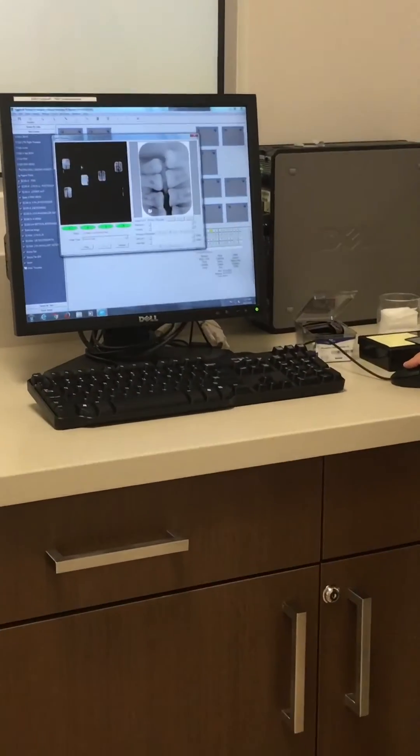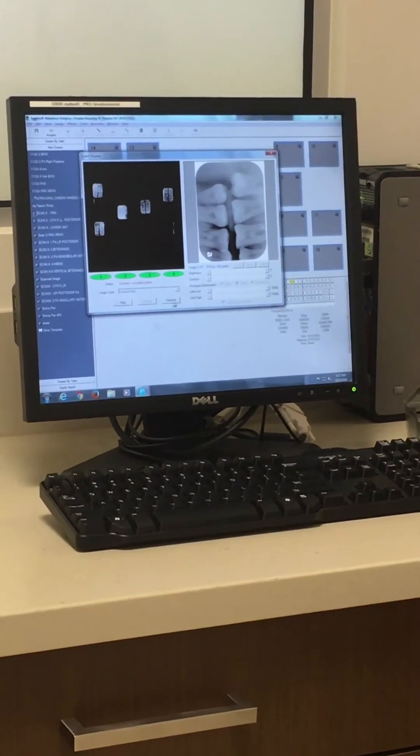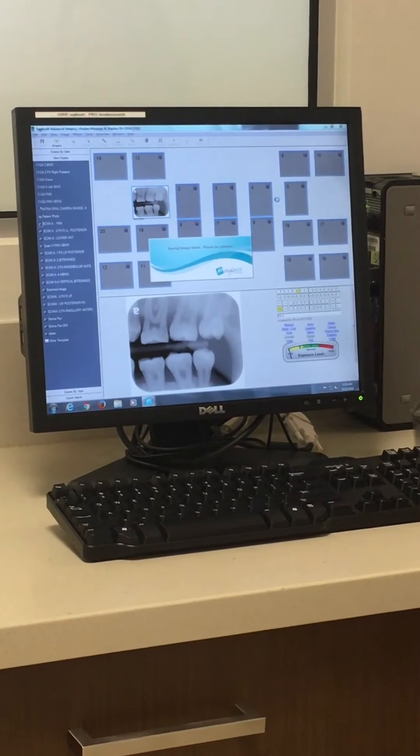Over on the computer, all the images will scan through to a certain point, and then a Finished option will appear. You can click Finished, and the images will distribute in the order in which they were scanned.